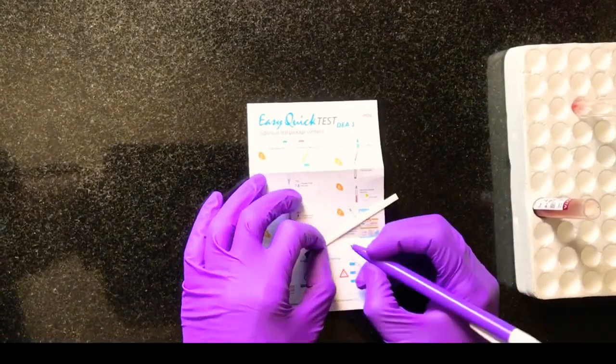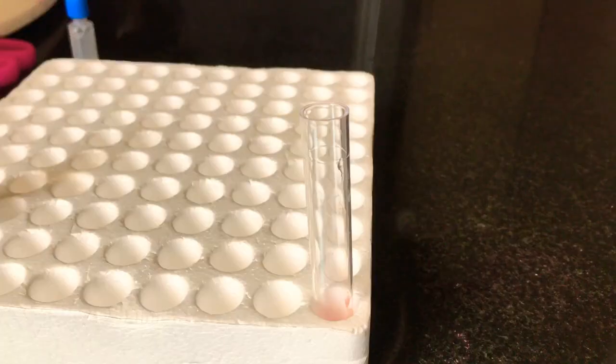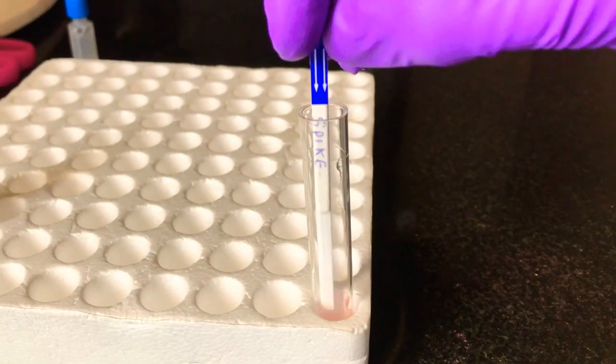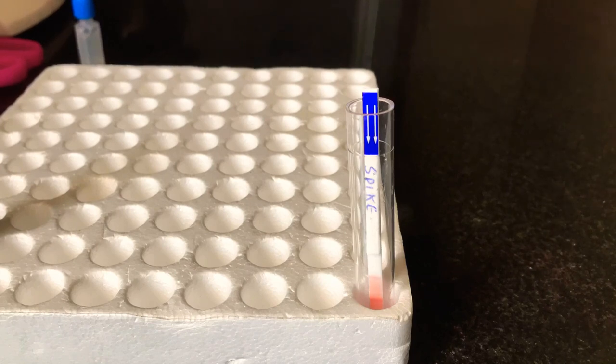After mixing, start writing the patient's details in the membrane given. Now keep the membrane in a vertical position and wait for two to four minutes. After some time you will be able to notice lines appearing on the membrane.